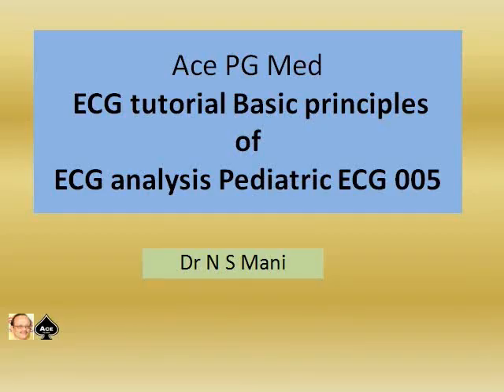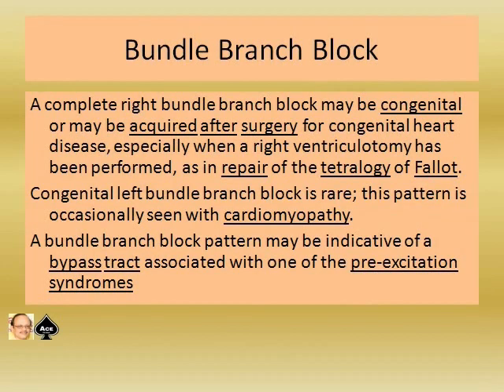This is the fifth part of the ECG analysis in pediatric patients from Dr. N.S. Mani. In the previous session we stopped with the bundle branch block. I'm resuming from that part.